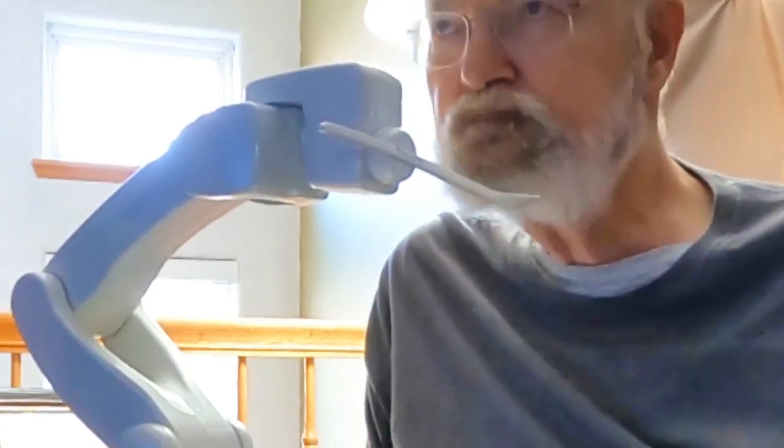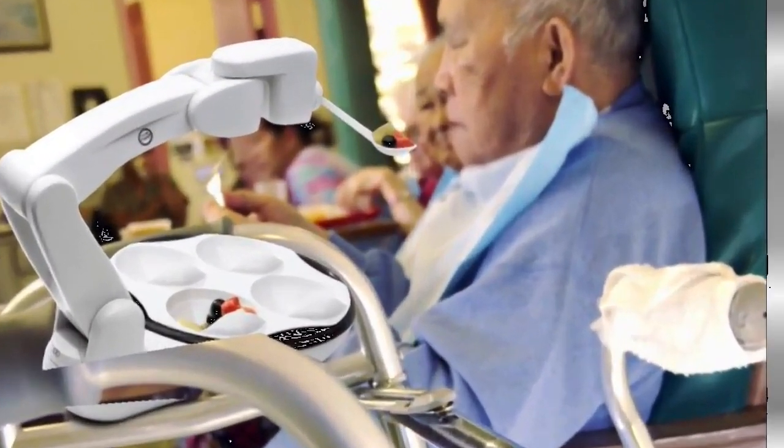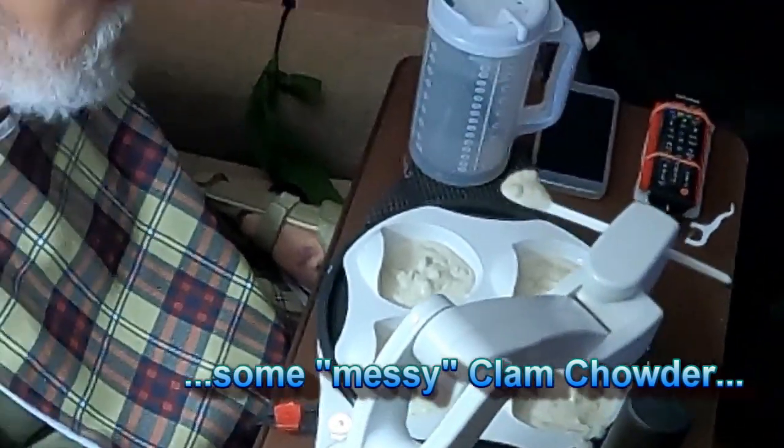Since I've already become a bib wearer a few years ago, that might not change if I want to keep those food drips from the cloth facade we call a shirt. But OB helps me out in that regard by wiping the bottom of the spoon on the dish before delivering it to my mouth on every spoonful.